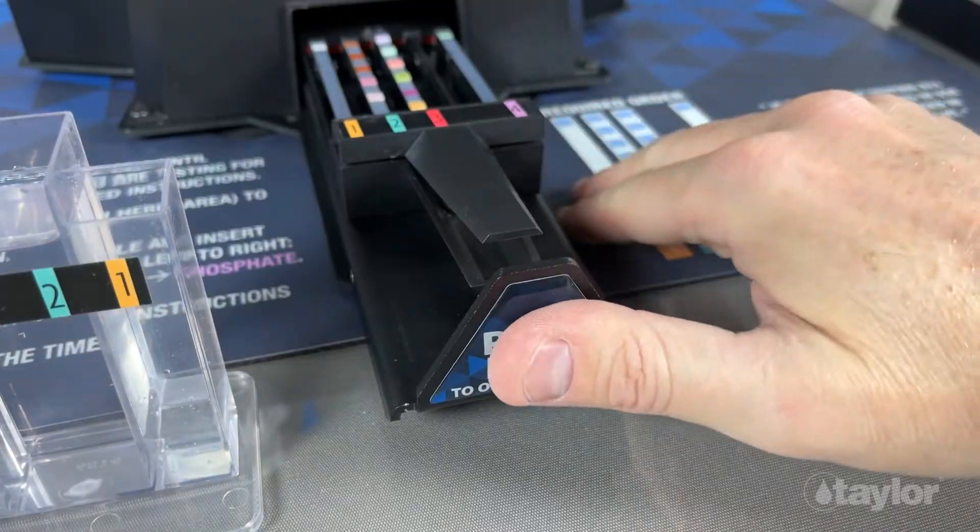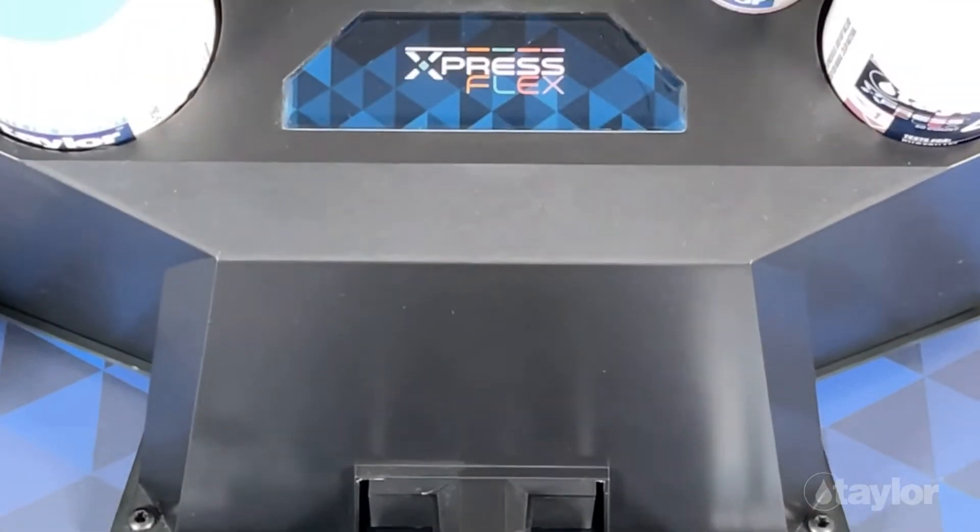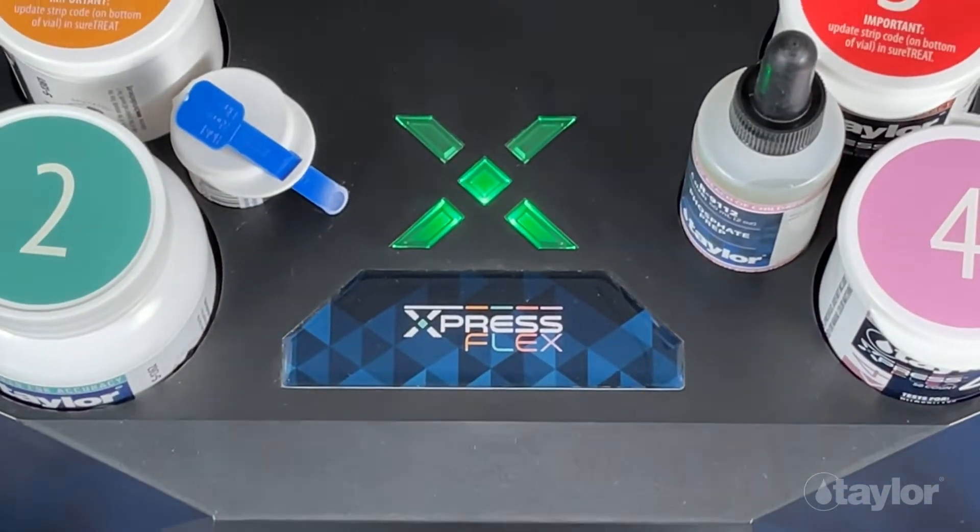At the core of the testing system is the ExpressFlex device. This is an advanced test strip reader that utilizes sophisticated technology to provide high quality test results.